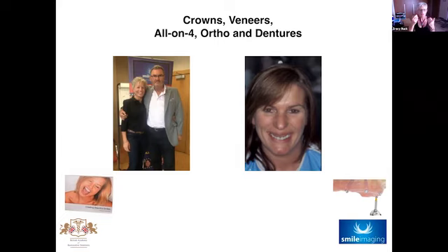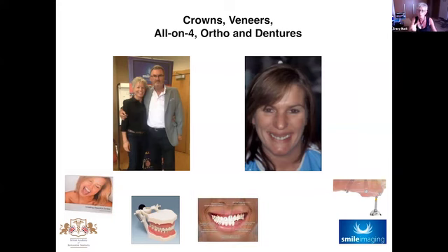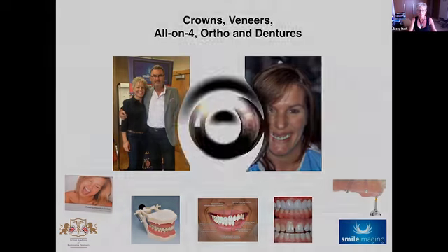Now, obviously, if you don't offer imaging, the way that we can show patients is with before and after books like this, or maybe some scary photos. You obviously need your diagnostic models on a case like this to find out what's actually achievable. And you might have some sort of computer-aided generated information to show the patient as well. And for those of you who've got before and afters of a similar case, that's really powerful and the next best thing to being able to show them in their own smile. If you've got somebody else's case, then that's the next best thing.